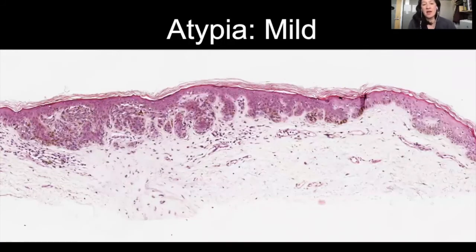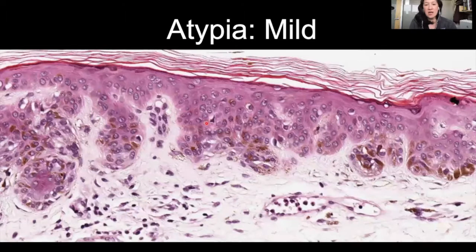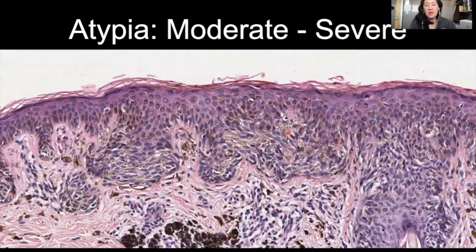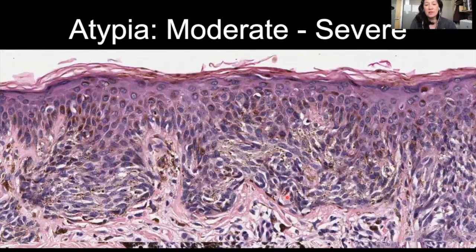Here's an example of a mildly atypical melanocytic nevus, mostly junctional, showing some nests at the tips of the rete ridges with a little bit of fusion between rete ridges. On higher power, these melanocytes are about the same size or a little smaller than the neighboring keratinocyte — so this would be mild cytologic atypia. Here's one that's a little worse, more moderate to severe, showing more extensive fusion between rete ridges and some extension down the follicular epithelium. On higher power, these melanocytes are spindled and there are some visible nucleoli.